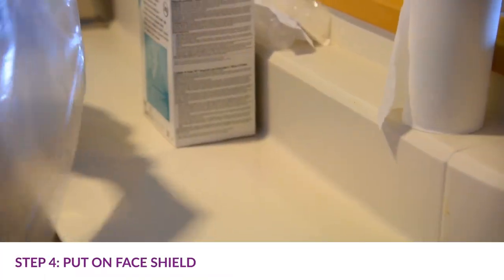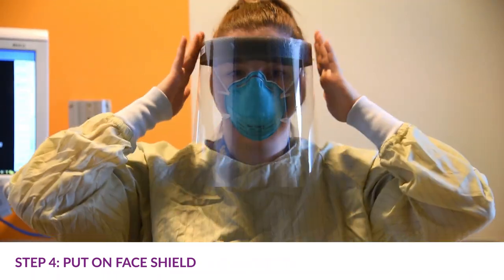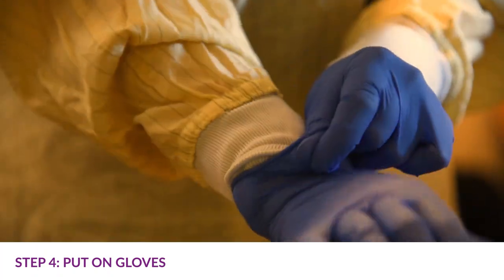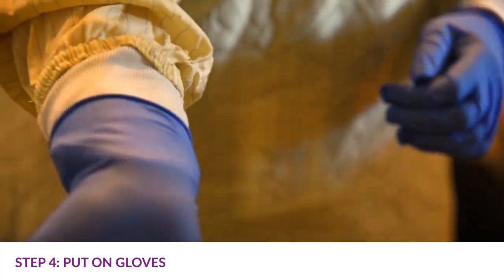Place the face shield over the eyes and face and adjust to fit. Put on a new pair of gloves and pull the cuffs of the gloves over the cuffs of the gown.